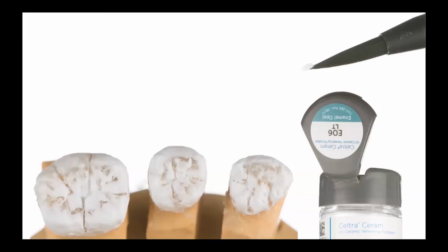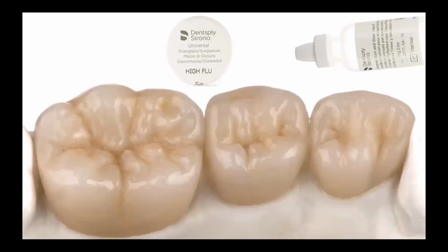And I keep on customizing it with the help of whitish opalescence enamel, like EO6 from the Celtra Ceram system. This porcelain material is very convenient for this technique because it's not necessary to provide a previous wash firing, and I can apply it in a thin layer on any segment of my restoration. That's very useful from the technical point of view. And I finish customization of my restoration with the help of high fluo glaze. I can add some stains in the occlusal fossa, for example, or emphasize some elements of this restoration.